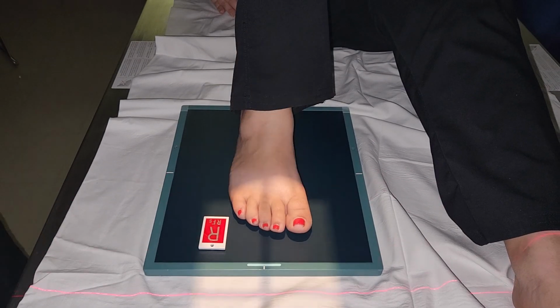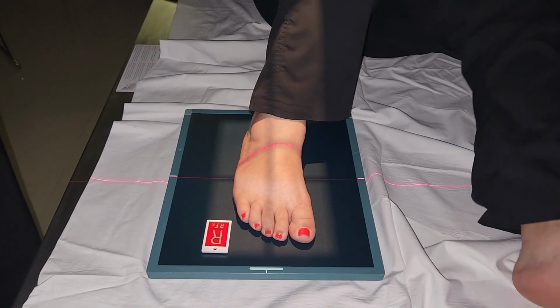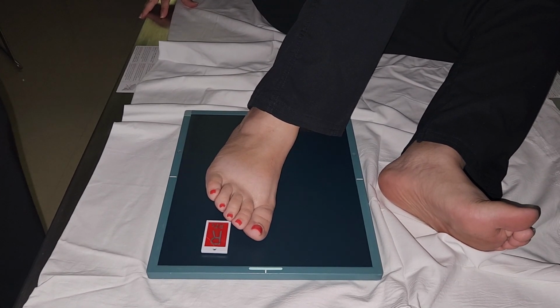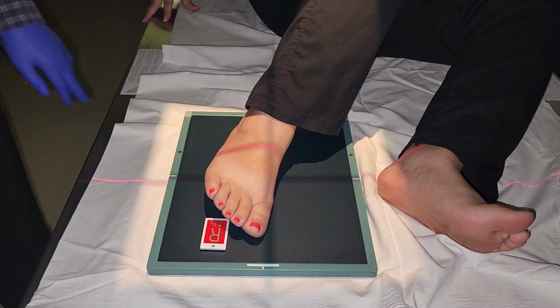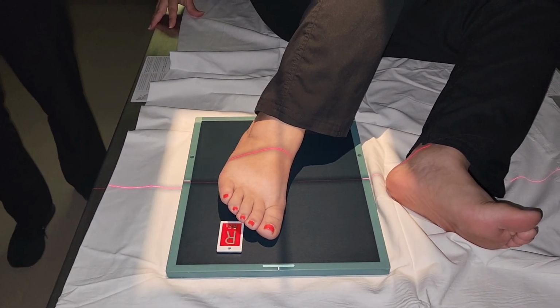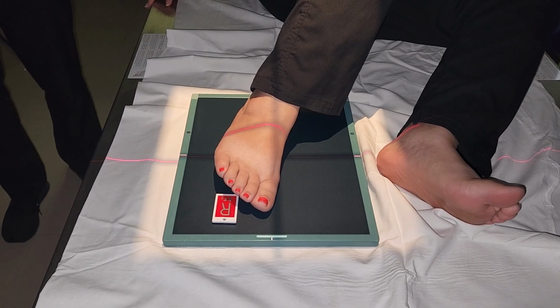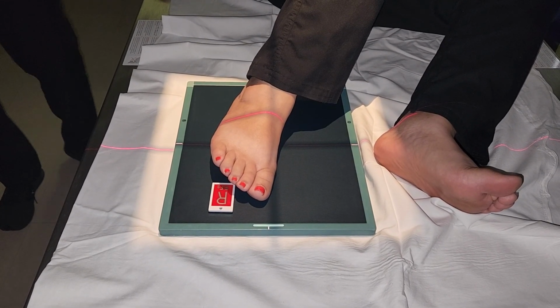All right, oblique foot, very similar to your oblique toes. Only real difference is your centering and collimation. So we're taking off our angle, we're raising this back to 40. As far as obliquity goes, we're only going to rotate the foot about 30 degrees. So you don't need to rotate the foot a lot. The main thing you need to make sure of though is that the foot is actually rotating. Once again, it's very common for patients to move their leg while the foot stays flat. So make sure the entire foot is rotating.